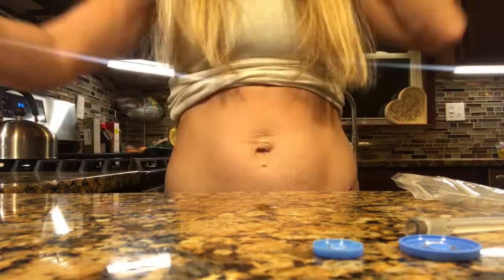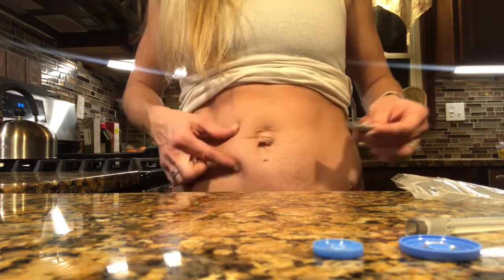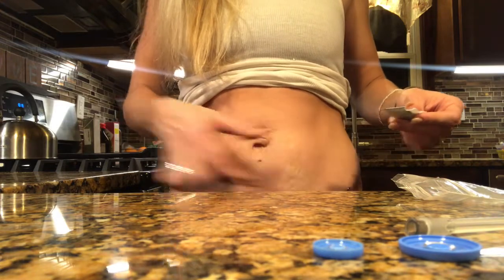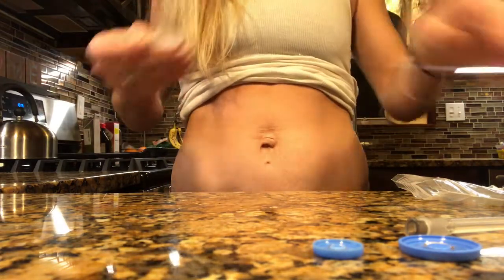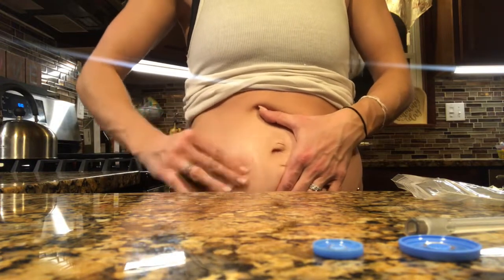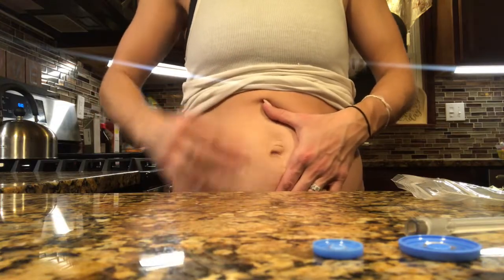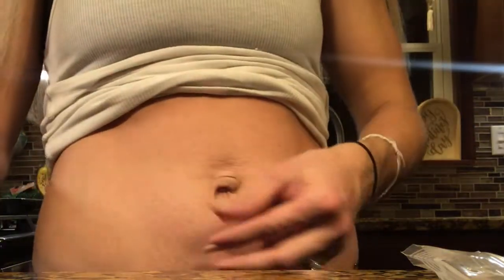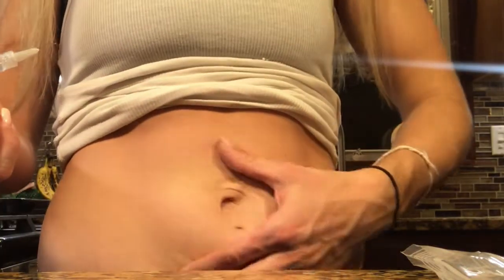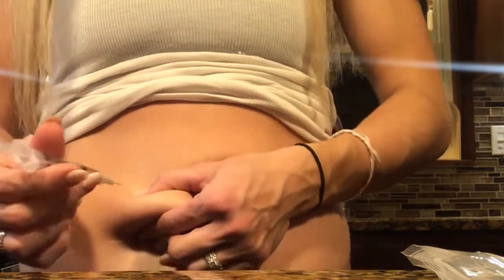You're going to want to administer this right around your belly button area — definitely not your belly button, but like right on one of these nice little meaty sides. Go ahead and take an alcohol swab and just clean that area.